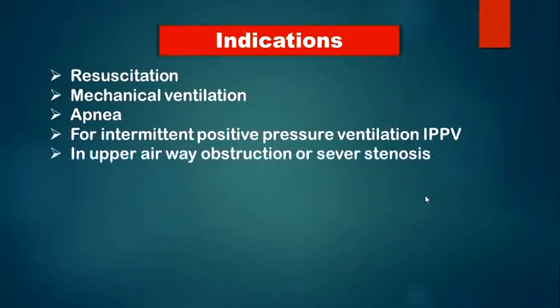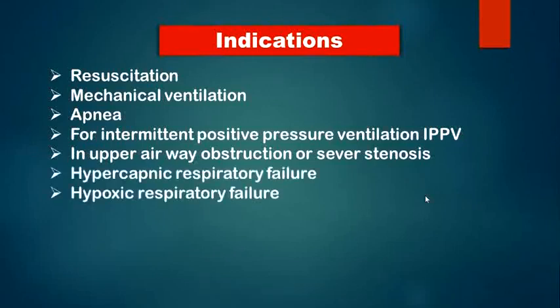And we use it for upper airway obstruction or severe stenosis that happens due to foreign body inhalation, or, for example, if there is laryngeal edema, and maybe due to hypersensitivity or allergy to something, or it may be due to infectious causes, viral or bacterial, like in epiglottitis or in severe croup. And hypercapnic respiratory failure.